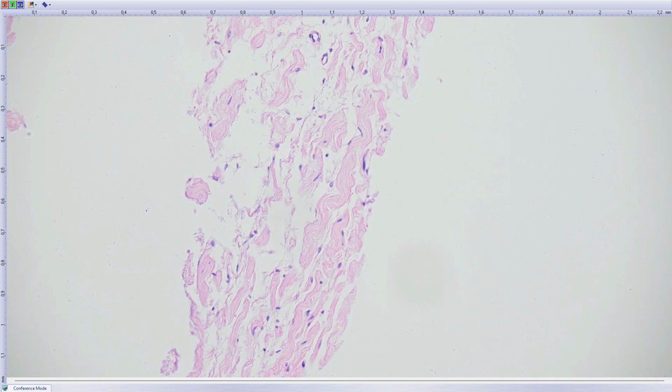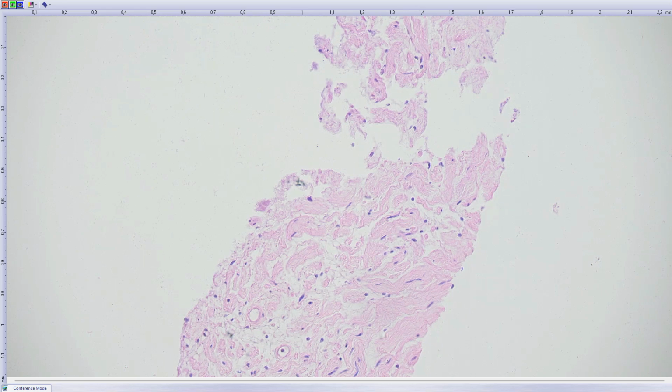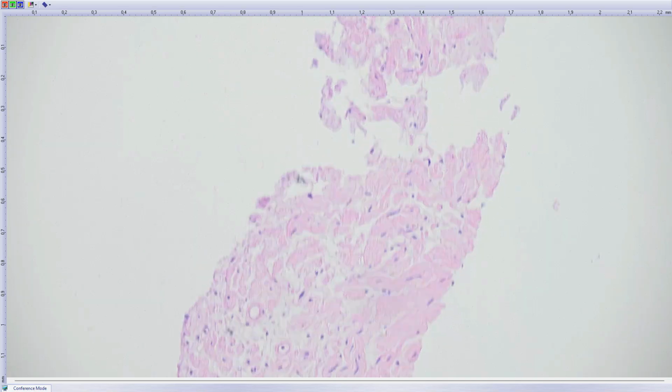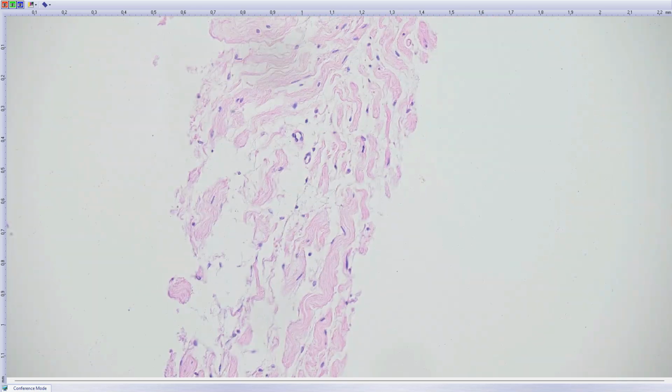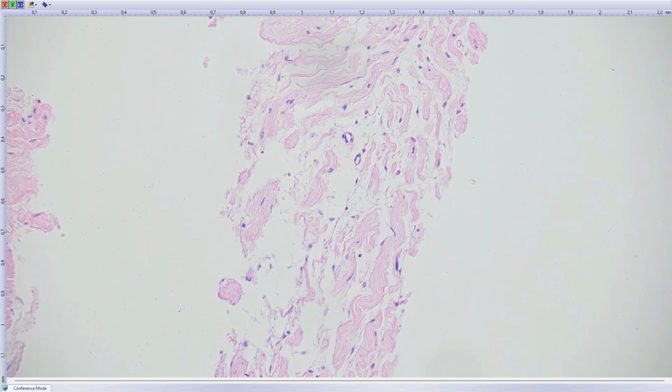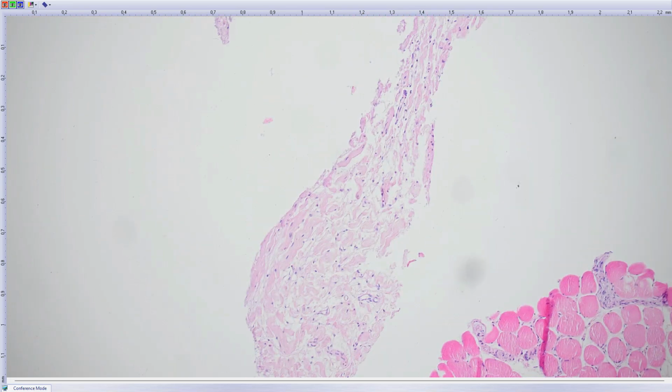So the differential here, it looks like a mesenchymal tumor. It looks like a more likely benign mesenchymal tumor. We still have to think about some malignant mesenchymal tumors, some sarcomas, which can look bland, such as low-grade fibromyxoid sarcoma. That's number one to exclude. But otherwise, we can think of some benign mesenchymal tumors with a lot of sclerotic stroma. So maybe fibromatosis, desmoid fibromatosis, which is unlikely here based on the morphology, and that's the one I favored, some neurogenic tumor.